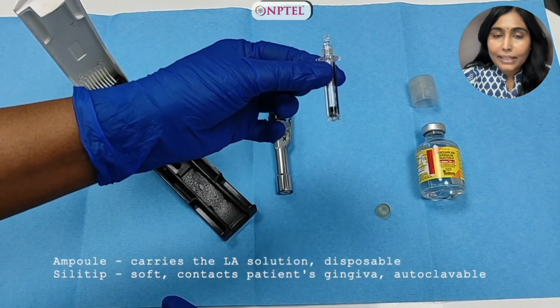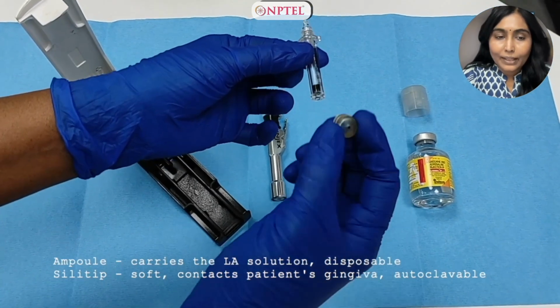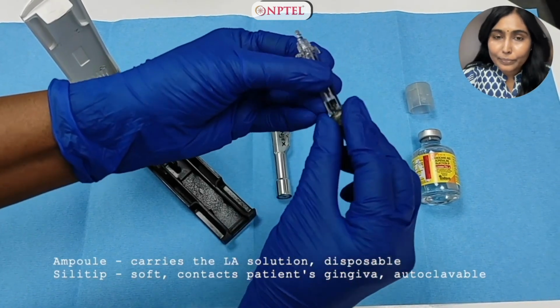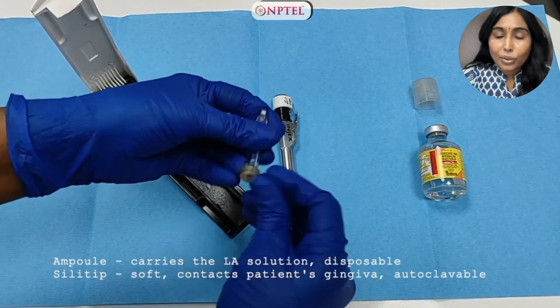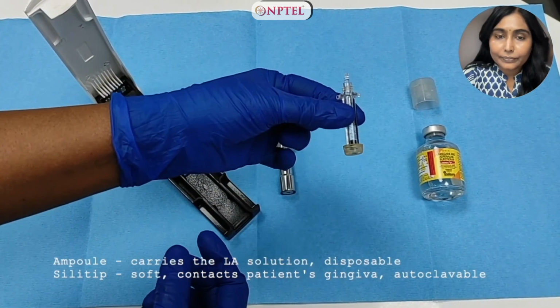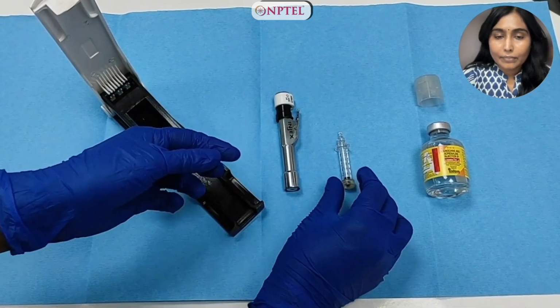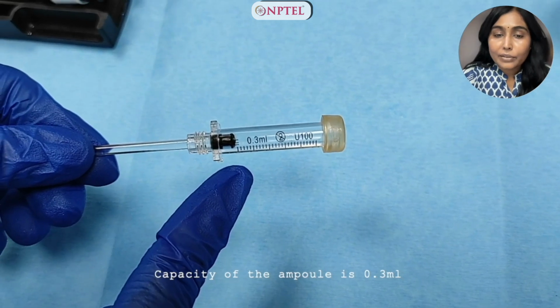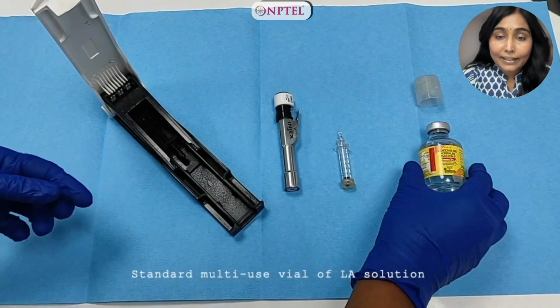The ampule carries the LA solution. This is disposable. And this is a silicone tip. It is soft. And this is the structure which contacts the patient's gingiva. And this is autoclavable. The capacity of the ampule, as you can see, is really small, 0.3 ml.